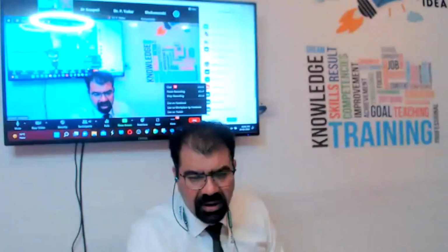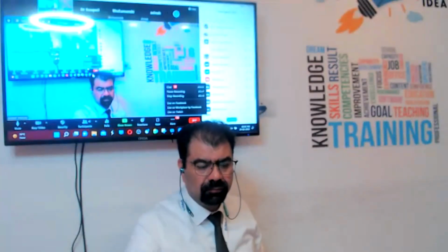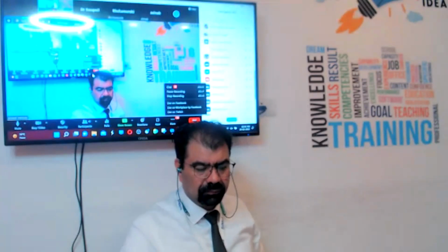So I wanted to ask one question. Yeah, what is your name? Sir, Dr. Zainab. Yeah. So sometimes we see that patient comes after taking the MTP pill for the abortion. They do a pregnancy test and say that the pregnancy test is weakly positive. Now they come for transvaginal sonography, we do transvaginal sonography. Sometimes we are unable to differentiate between the retained products and the thickened endometrium.